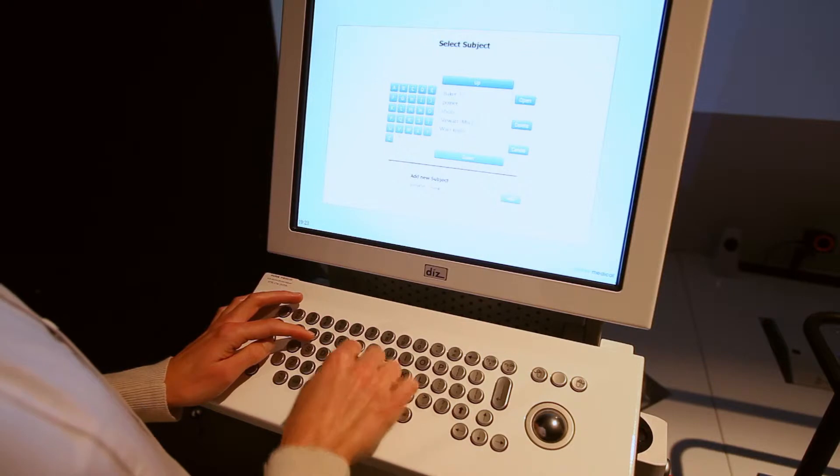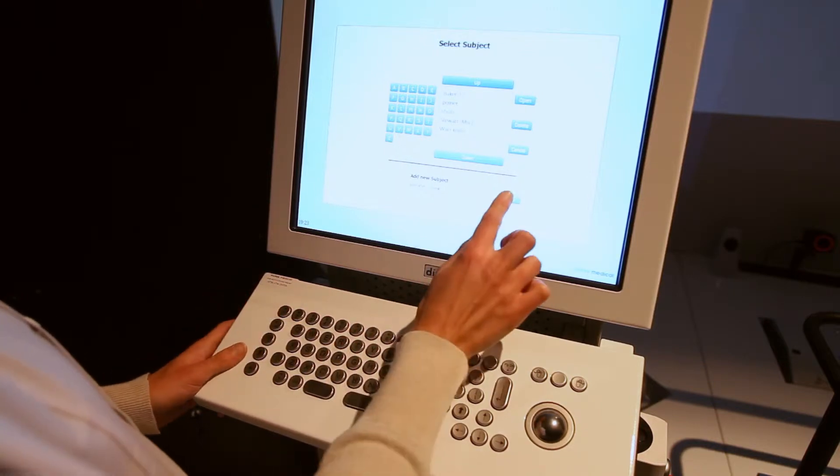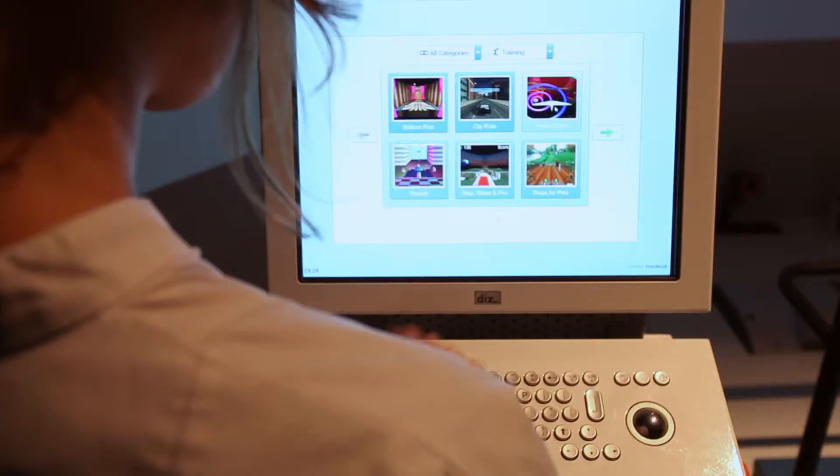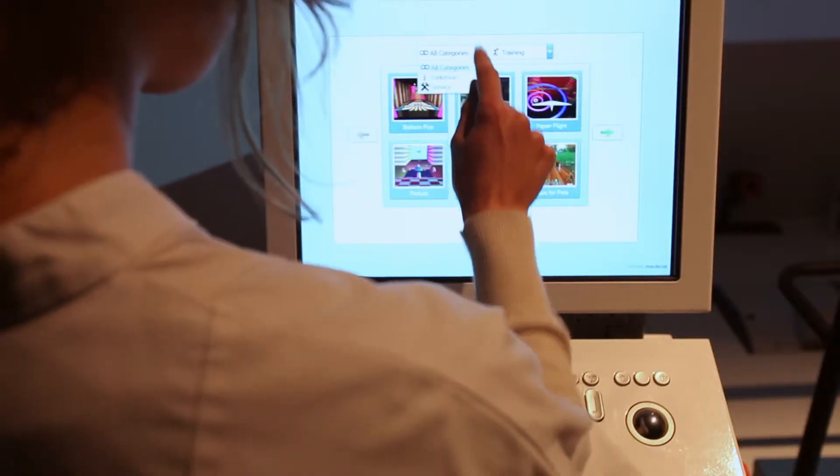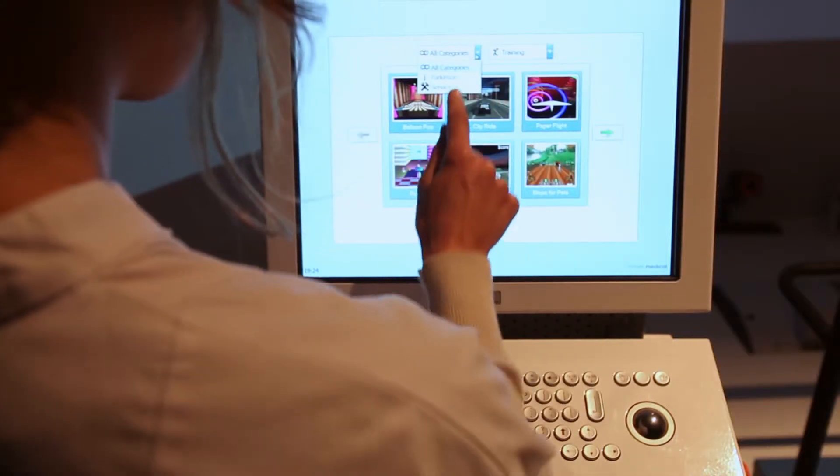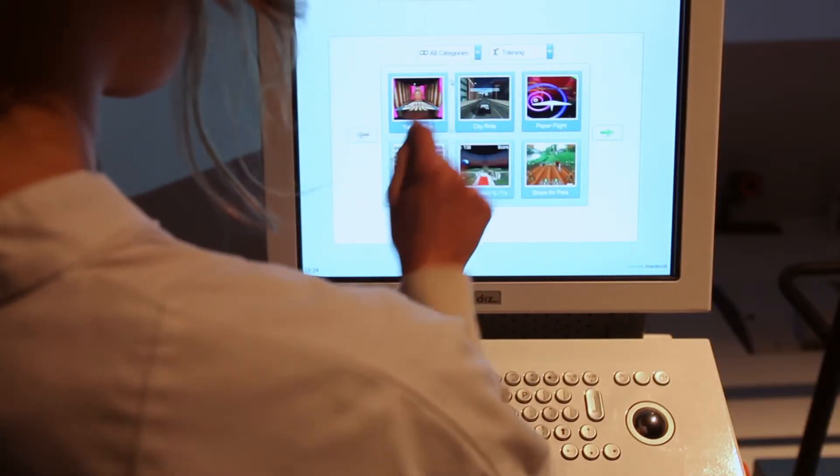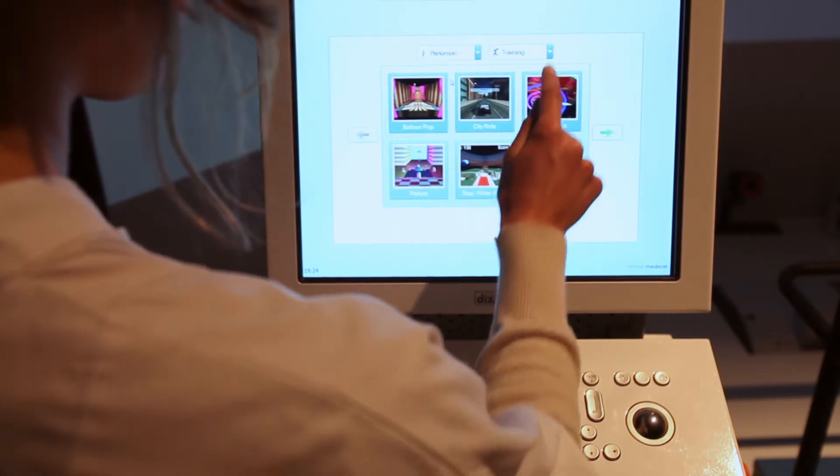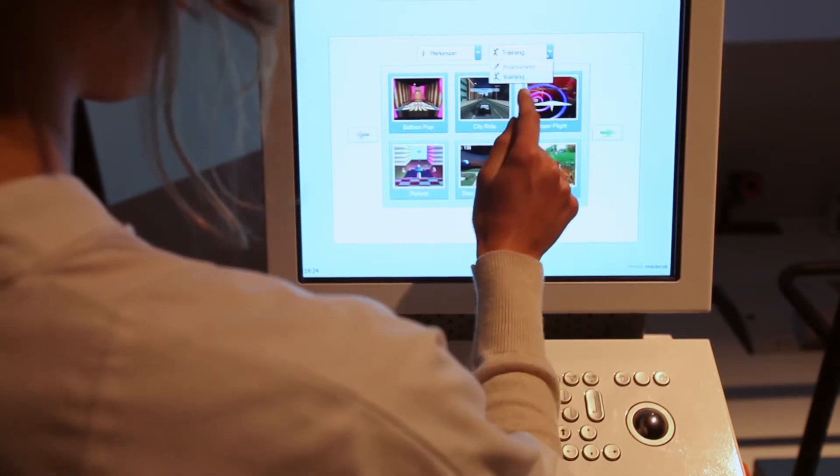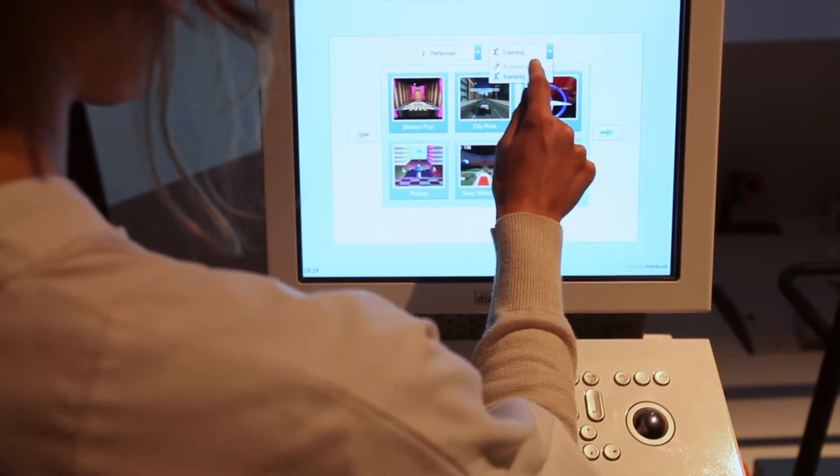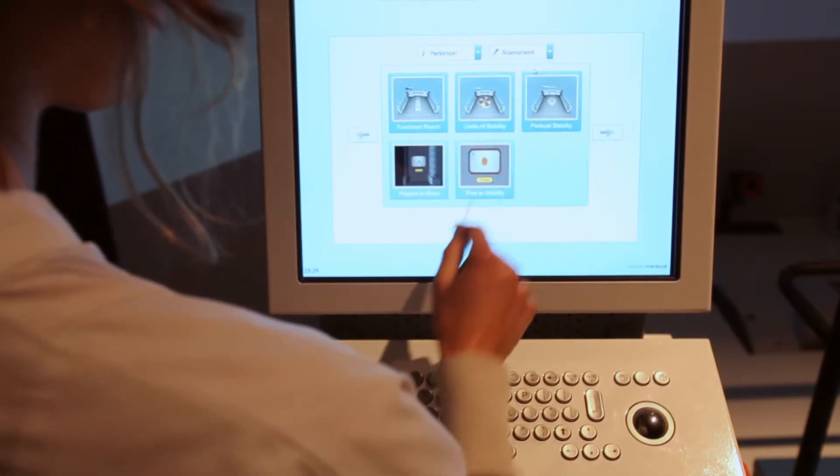Add or select your patient using the touchscreen and keyboard. Choose a patient group from the drop-down menu. Now decide whether to do an assessment or a training session.